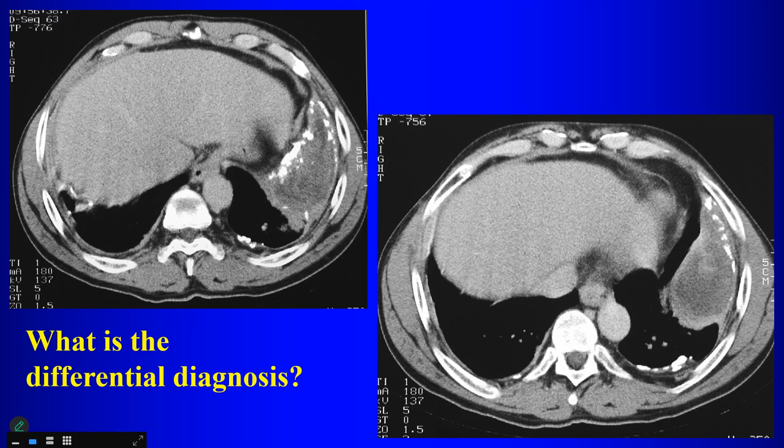What if the patient had a history of a motor vehicle accident many years ago? Yeah, chronic hemothorax, organizing hemothorax can also give you an organizing pleural collection. About the asbestos exposure, would you expect fluid collection or just pleural plaques? You get both. Pleural effusion is associated with asbestos-related pleural disease. It is a cause of pleural effusion.